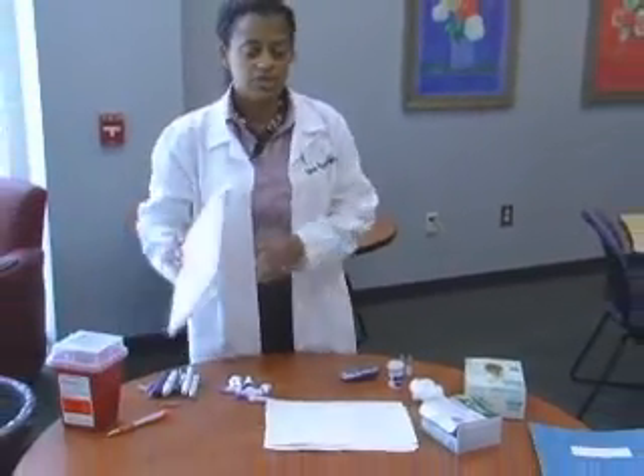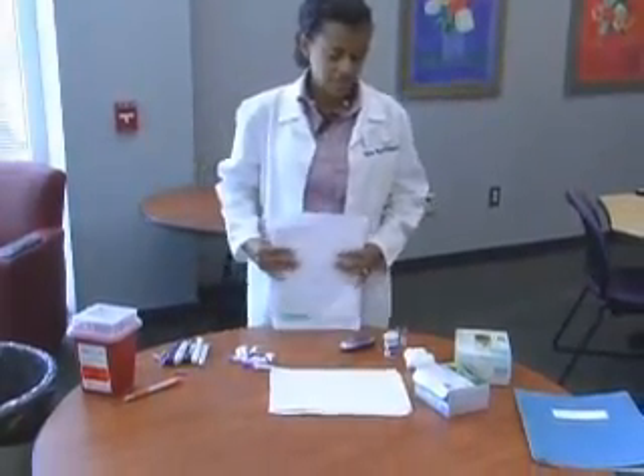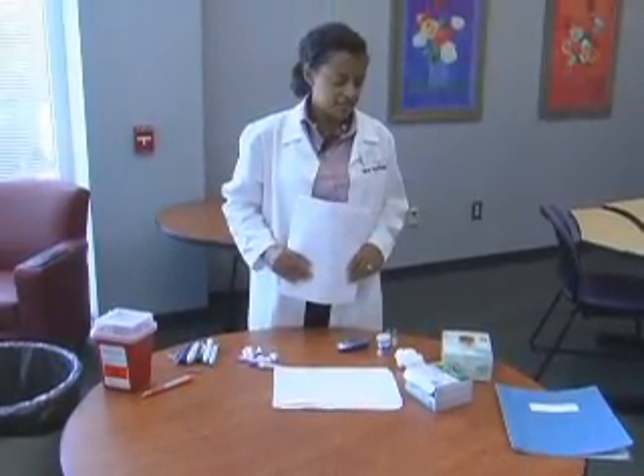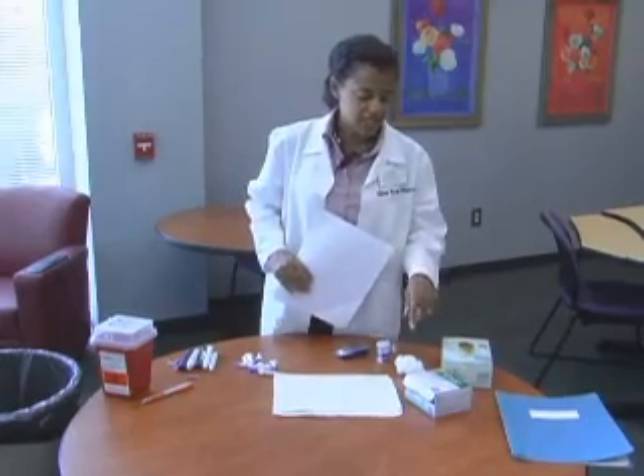The first thing we're going to go over are the materials that you will need in order to check blood glucose as part of your blood glucose screening session.